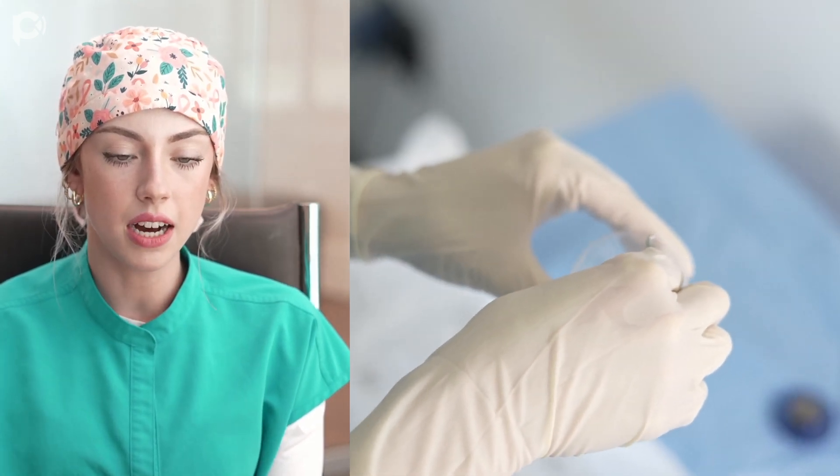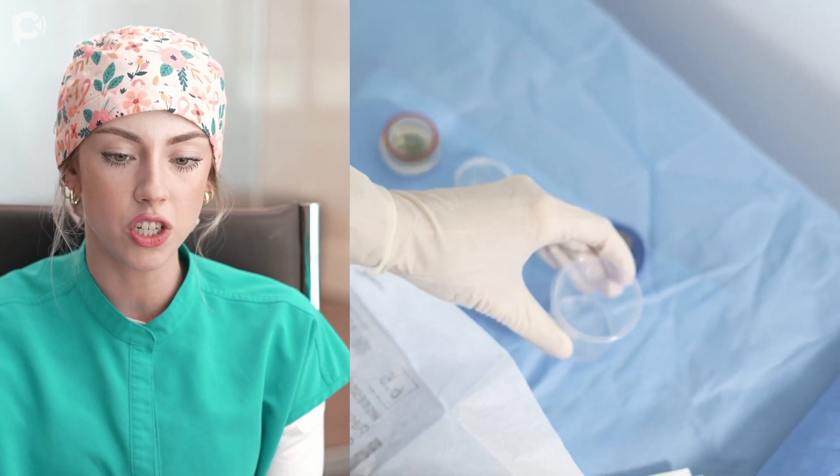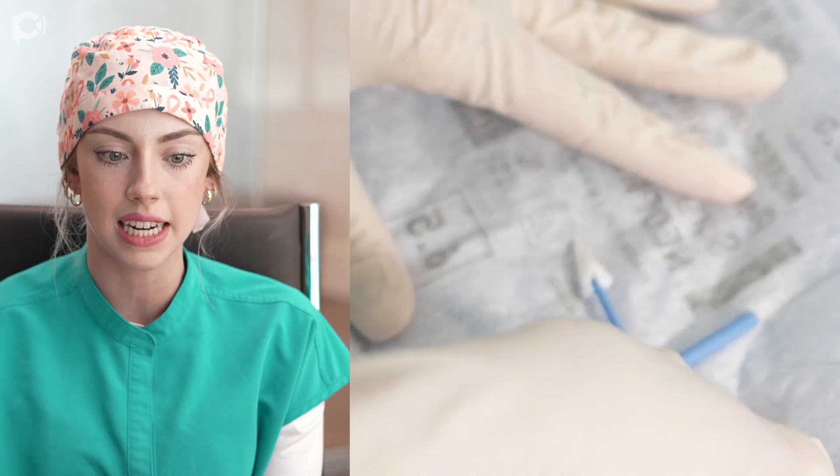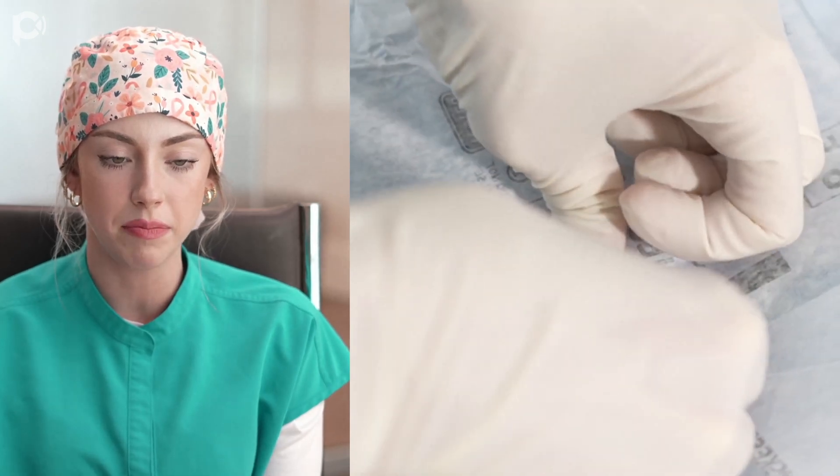The segment comes in an albumin solution, so we just want to rinse it in some BSS to get that off. I rinse it for about five to eight seconds in a little plastic cup full of BSS.